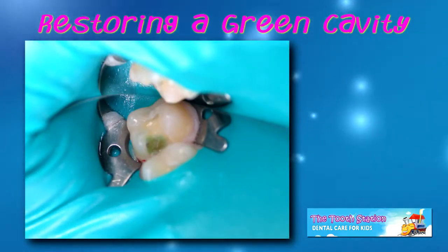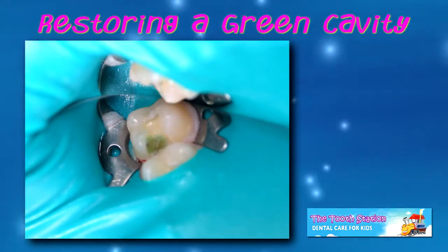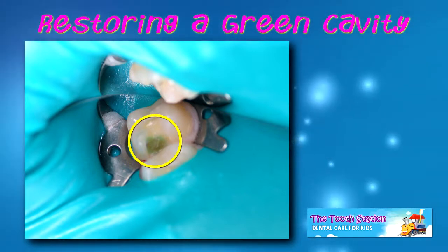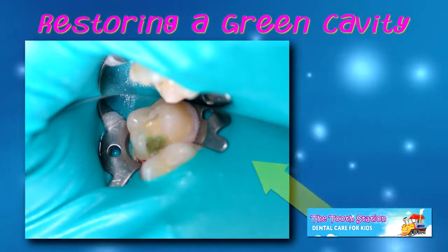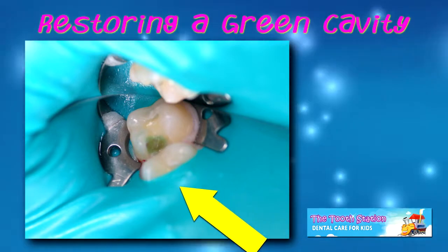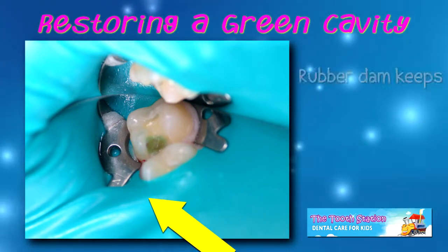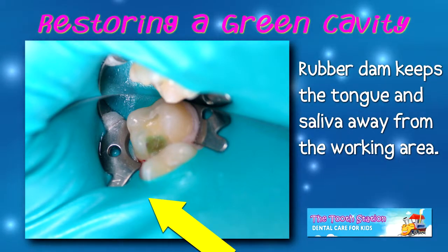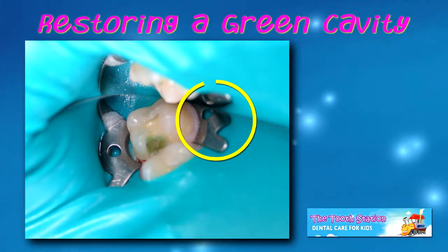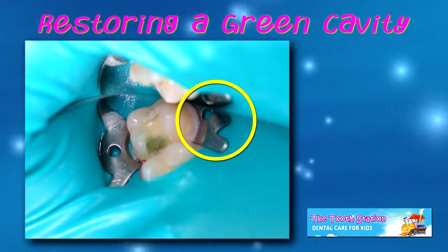This is the tooth after part of the cavity has been removed, and the green seems to be an even more intense green than before. The blue material around the tooth is called a rubber dam and is used to aid in fixing the cavity by keeping the tongue and saliva away from the working area. It is attached to the tooth with a rubber dam clamp.